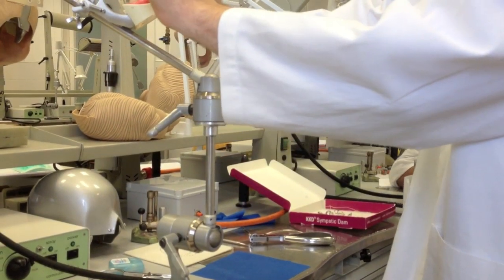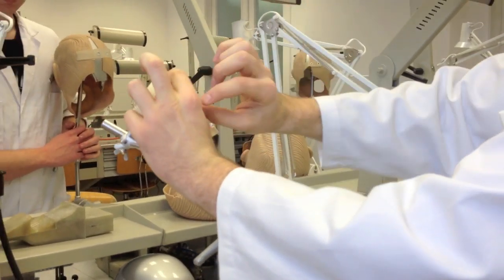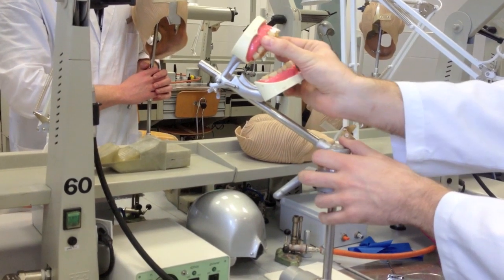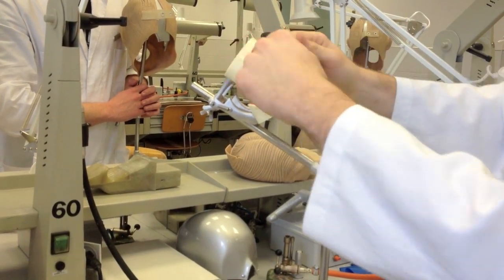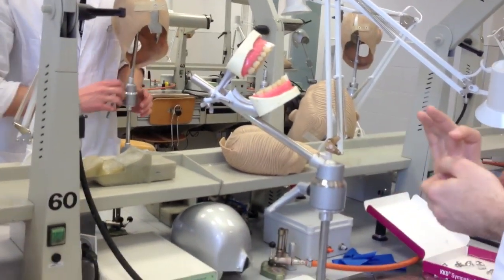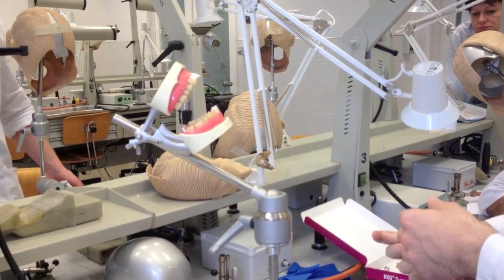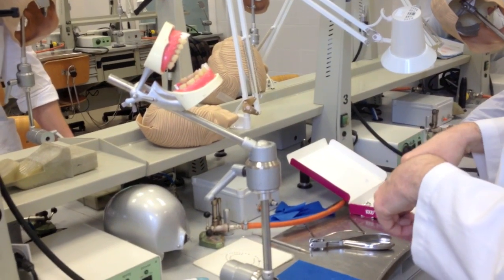First option: place the rubber, hold it in place, then place the clamp. Second option: place the clamp, after that pull the rubber through the clamp, or pull the clamp through the rubber. The third option is when you place the clamp and the rubber together. The two subclasses for this are if the clamp has wings, or if it's a wingless clamp.